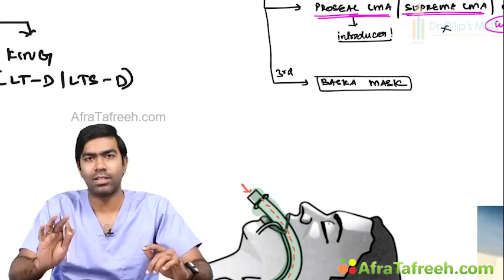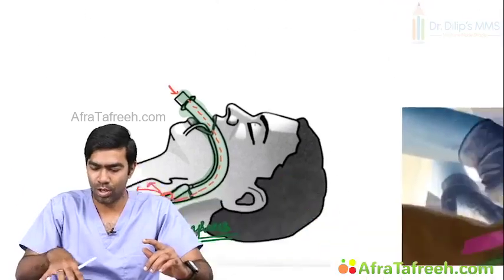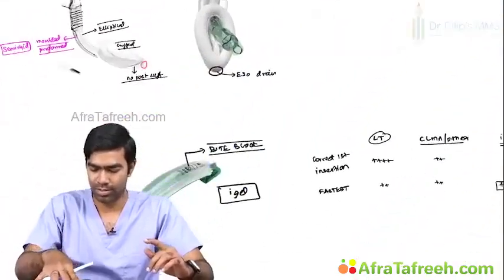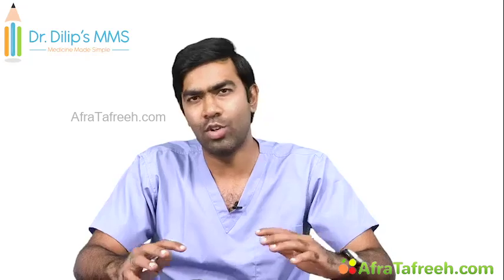Baska mask is a third generation LMA. So why do you need this third generation LMA? Let us see what the Baska mask is. So this is the Baska mask. There are numerous advantages with this Baska mask. They have rectified some more mistakes also.